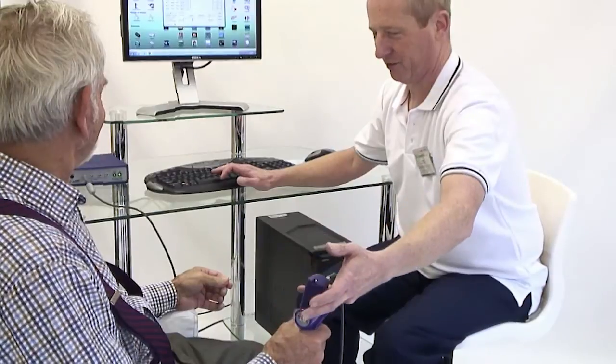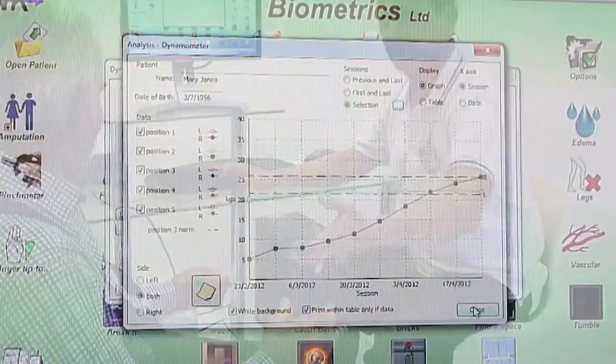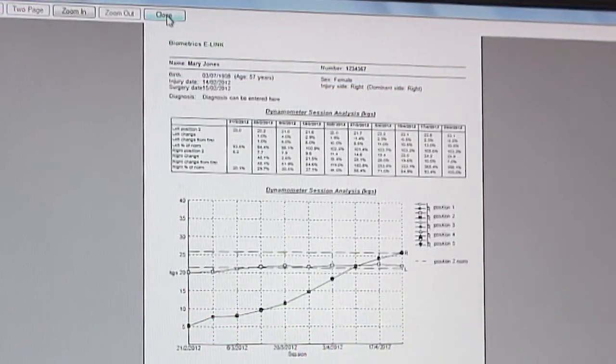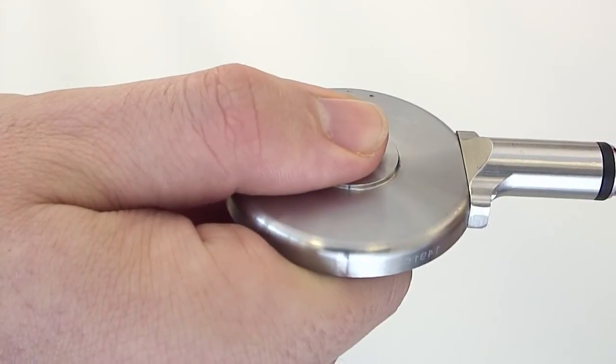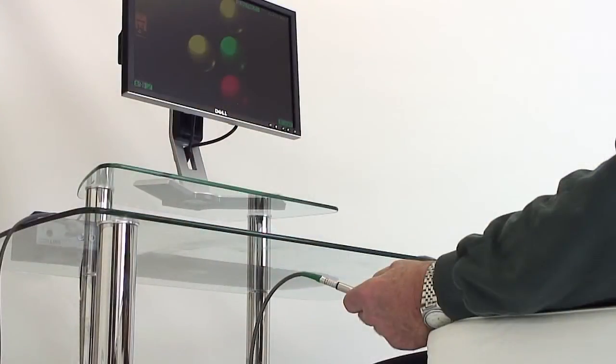Formal evaluations of the patient's grip and pinch strength can be assessed with the dynamometer and pinch meter, and progress reports can be generated for outcome measures. The instruments are accurate, sensitive devices, registering as little as 0.1 kg strength measurements, thus enabling evaluation to commence very early in the rehab process.